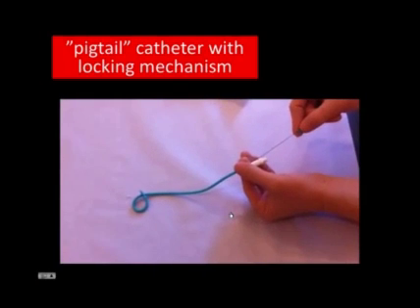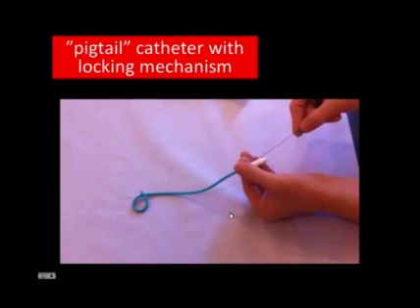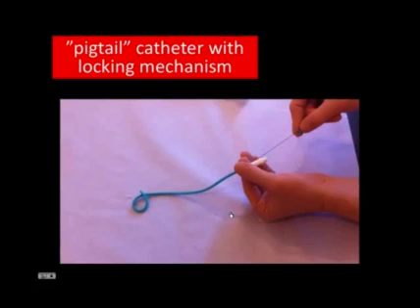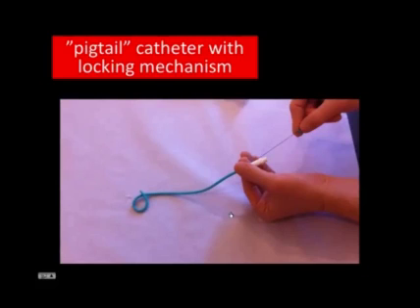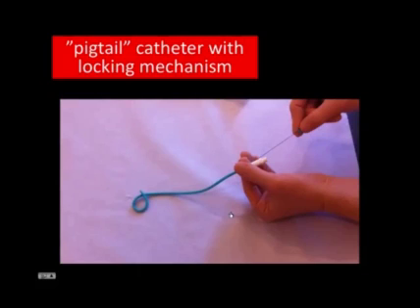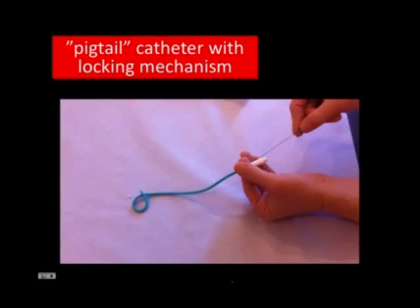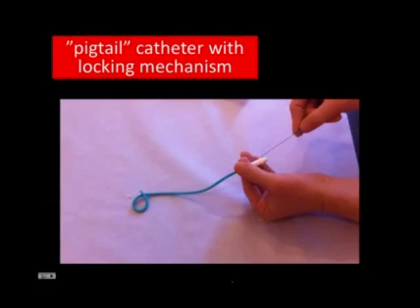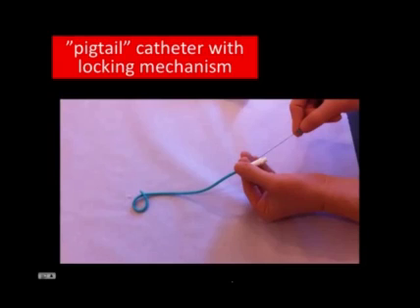In this particular catheter model — a Skater manufactured by Angiotek — by pulling the wire, the coil is firmly locked. We customarily use a 7 French catheter, but 8 and 9 French are similarly acceptable.